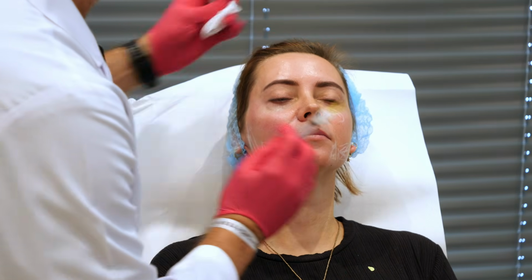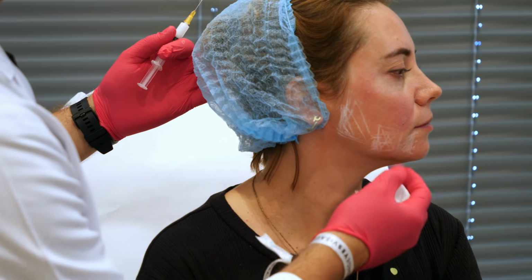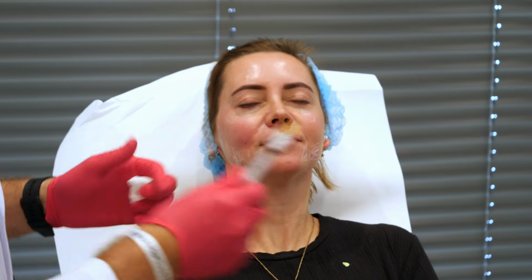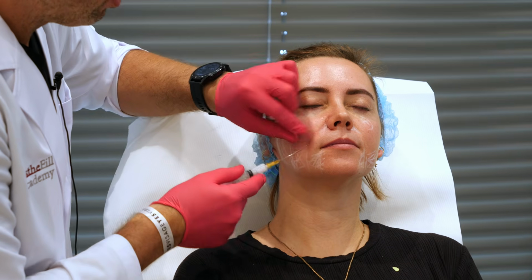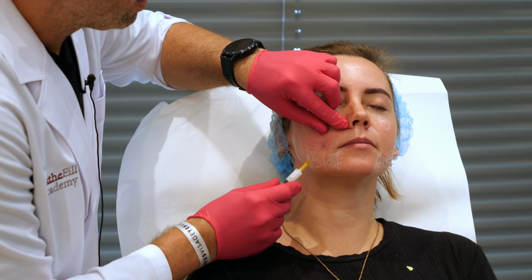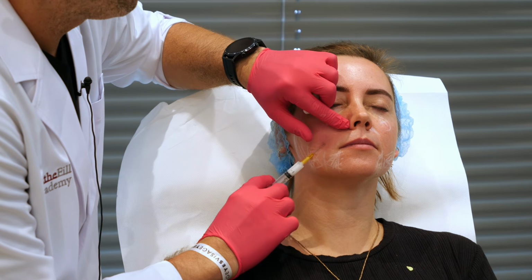Okay, you can see, sit down please, in the lateral plane our negative vector is resolved. Okay, you can see it? Let's go with a small amount, about 0.2. It is not a cohesive product, but in the correct plane it gives us a better result for volume. Here, slowly, don't forget the facial artery here.